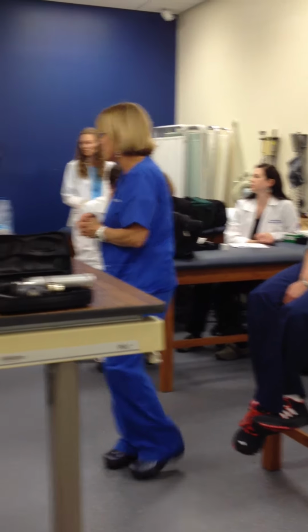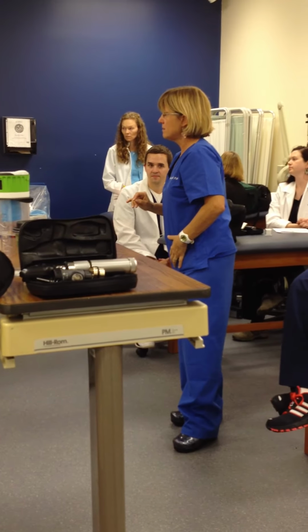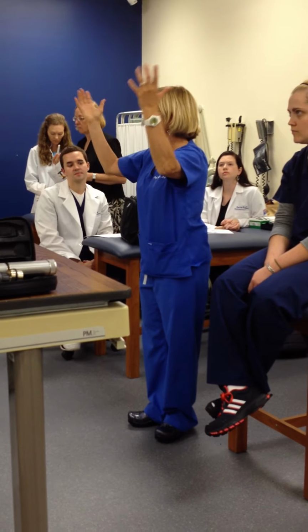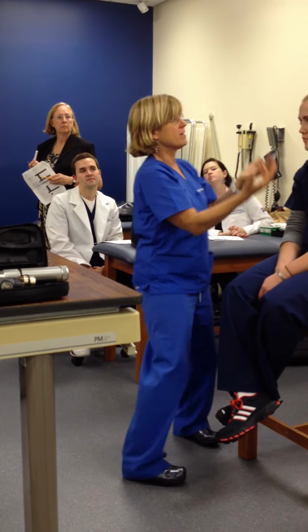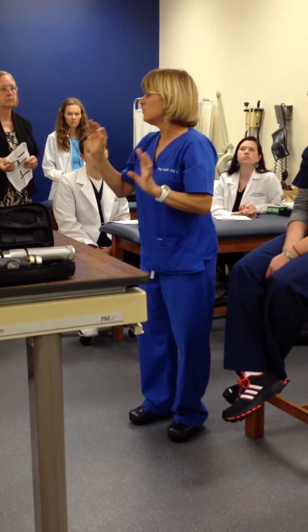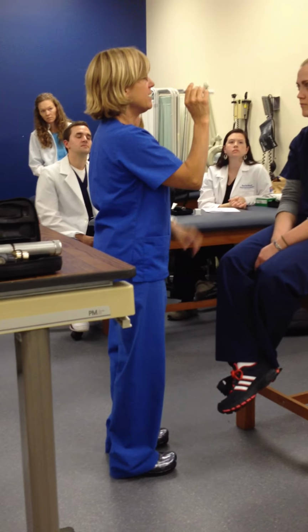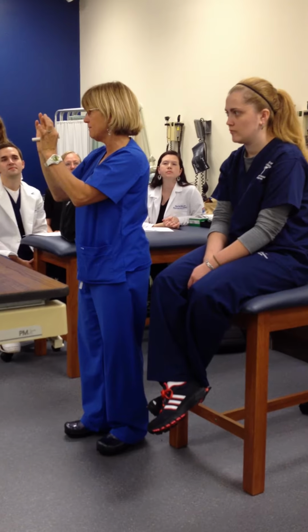Excuse me, did you repeat that last part as far as with the pen light and the lighting being good in here? You have her gazing over there. You know how I look at your eyes, when you're practicing this, look at each other's eyes. If there's nice lighting in here, we can see light reflection. It's pretty symmetric. As I just look in your eyes, I can see the beautiful light reflection. Probably it's a little more accurate to use a pen light, and just look at my nose here, and we just shine the light, and we see that the reflection is in a symmetric spot on both pupils, or both eyes.